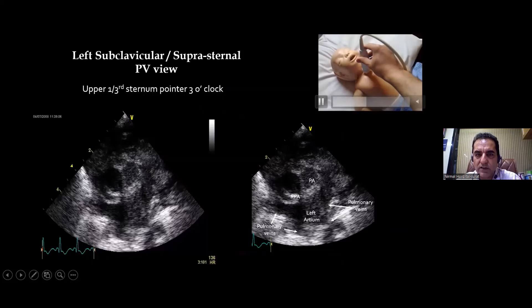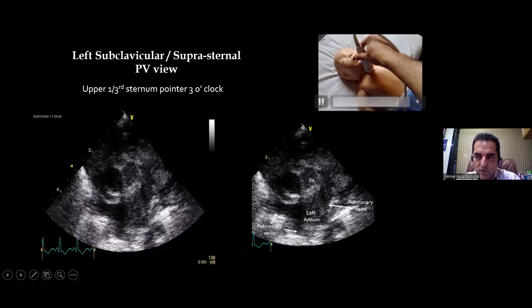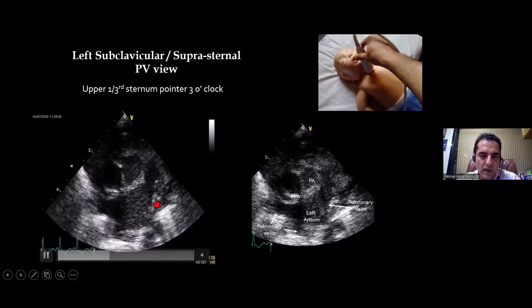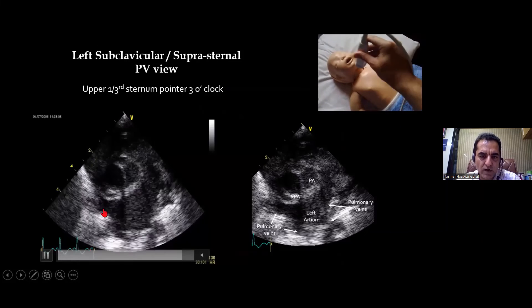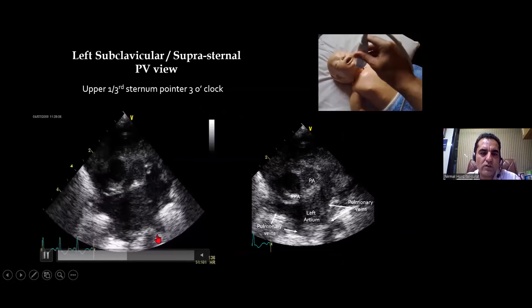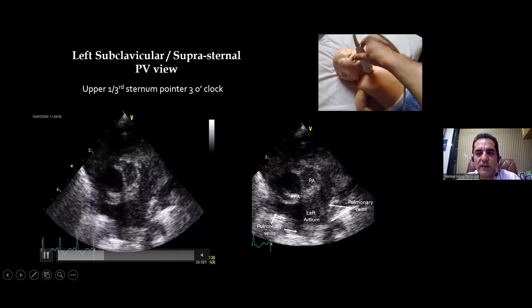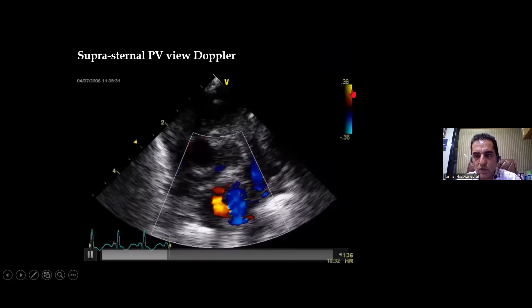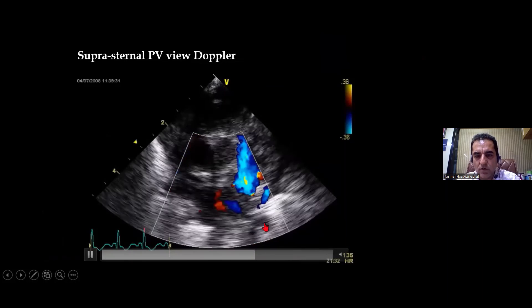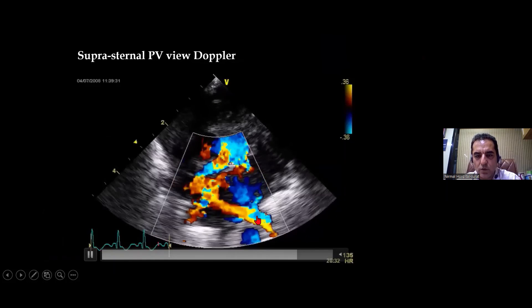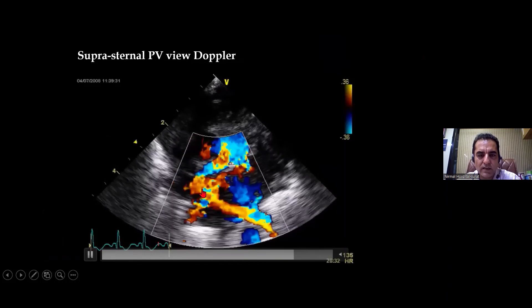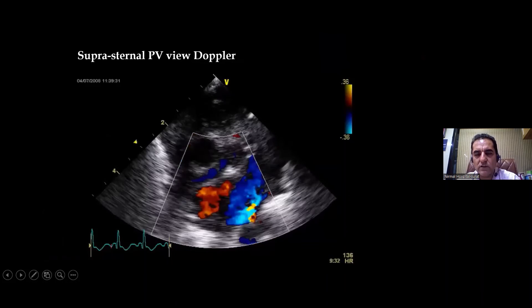In the same position with the pointer at 3 o'clock, sweeping the probe downward toward the feet opens up the pulmonary vein view — also called the crab view. The pulmonary artery remains visible but now the left atrium opens up, showing all four pulmonary veins entering it, resembling a crab. With color Doppler at a reduced velocity range for venous flow, you see red flow from the pulmonary veins: left lower, left upper, right lower, and right upper pulmonary veins entering the left atrium.